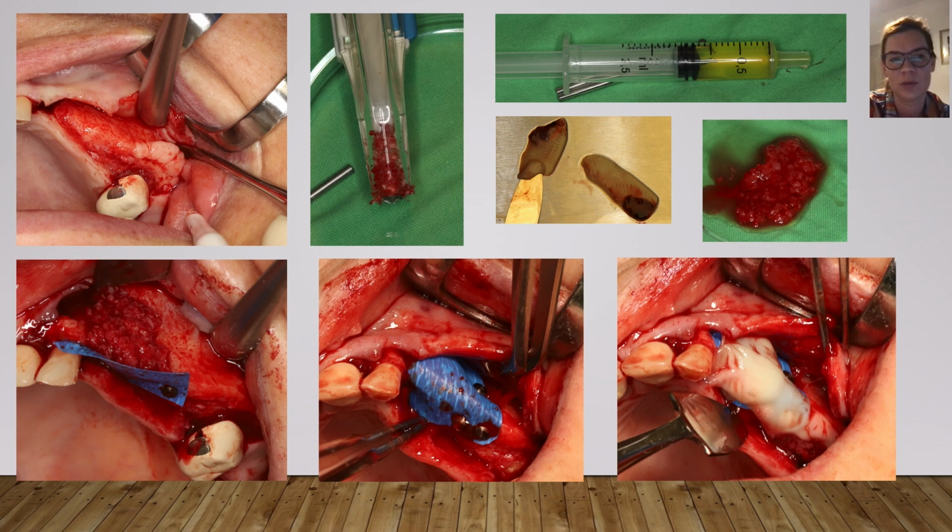because I had to make a little vertical augmentation as well, not only horizontal, and in the horizontal dimension it was a quite big defect, so that's why I decided to use a non-resorbable membrane in this surgery.